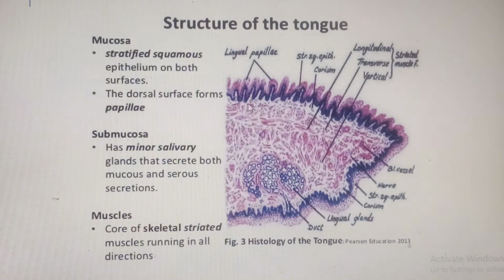So, to give it that kind of nourishment through diffusion of those molecules via what we call the non-cellular basement membrane. So, this one over here, can you see that the epithelial lining will be dipping in there? And these ones, as they invade the area of the loose connective tissue underlying the lamina propria, that is what we call epithelial pegs. So these things that you find over here extending into the underlying connective tissue from the epithelial lining are what we call epithelial pegs.